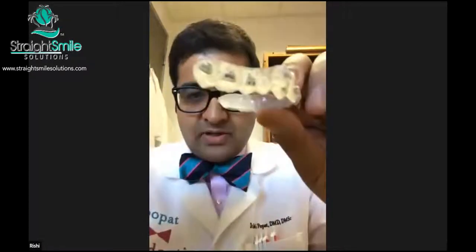So if you wanted upper right three, you would have a little small jig and the bracket would just go on. Some doctors would save that, so if you're worried about bracket failures you can section it. Some people do that with the Invisalign attachments as well — same concept, same principle. You just section it and mark all the teeth.